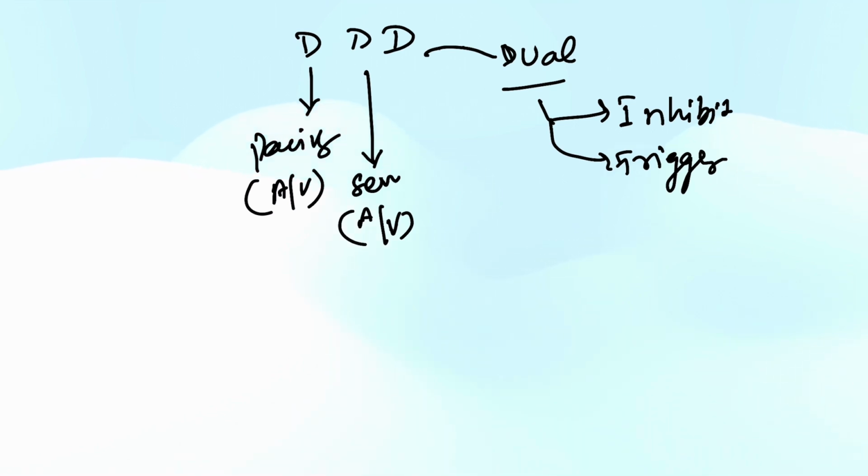Let us consider a patient in the ICU for whom some surgery is being planned. What mode should be set for the intraoperative period? In the OT there are multiple things that can interfere with the electrical circuit. One example is cautery and other movements. So what mode for surgery?